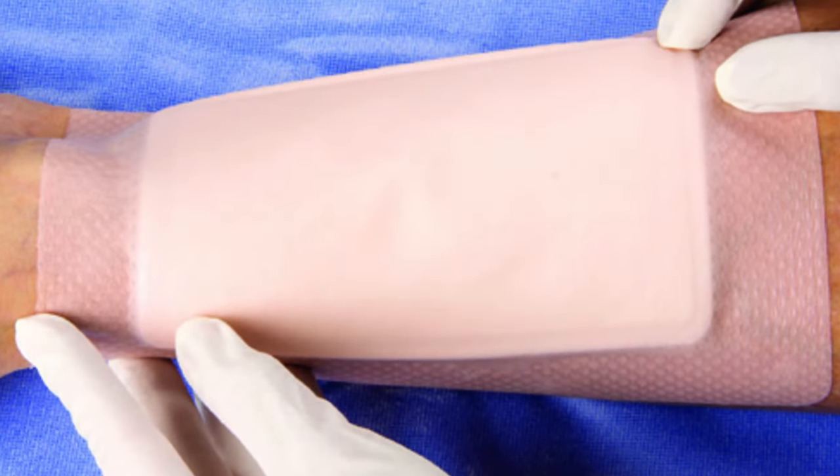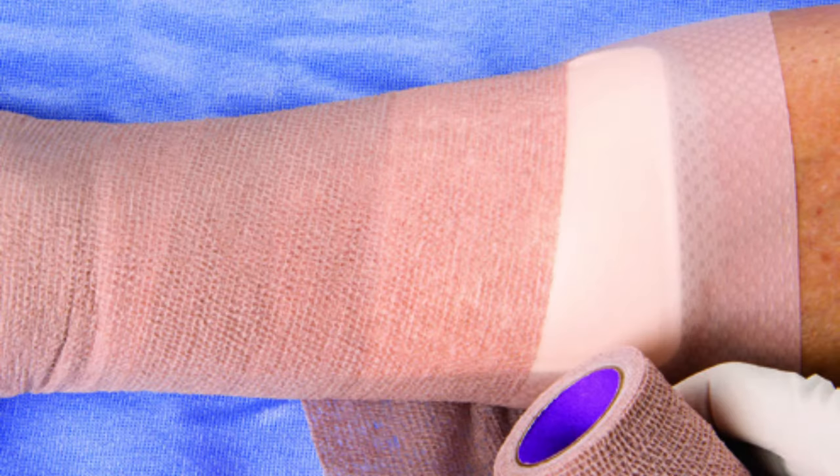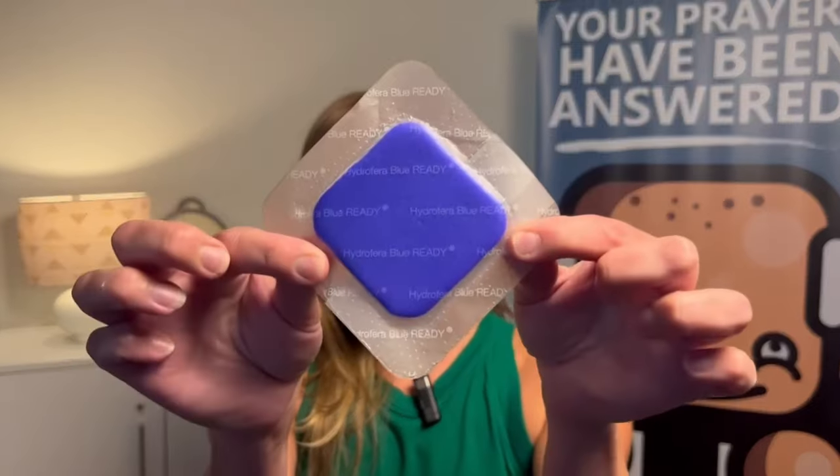The point of the Transfer is there's no film to prevent seepage through it. The whole point is to allow the exudate to come up, be wicked away into that secondary dressing, and evaporate out. So we're still maintaining our best-case scenario for wound healing with the best possible moisture balance.